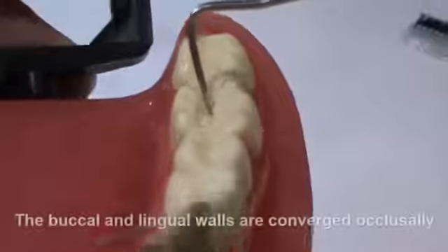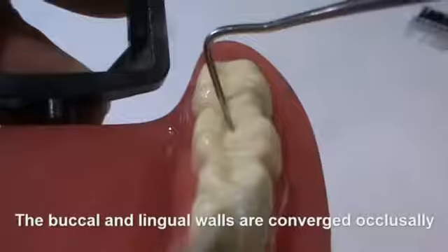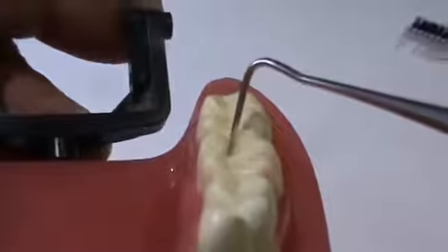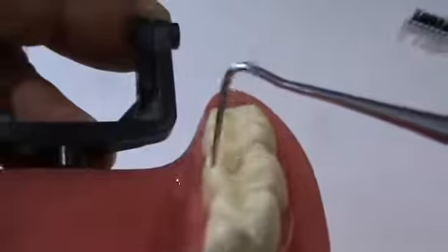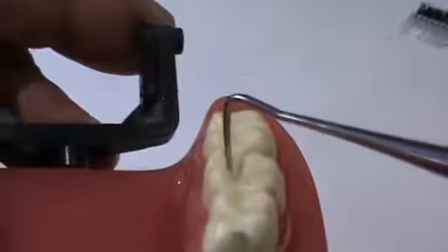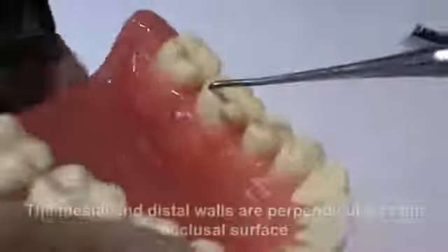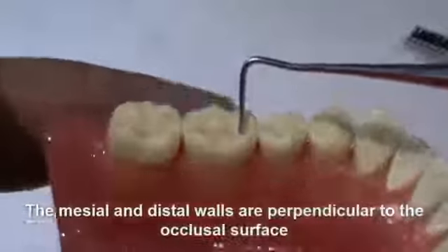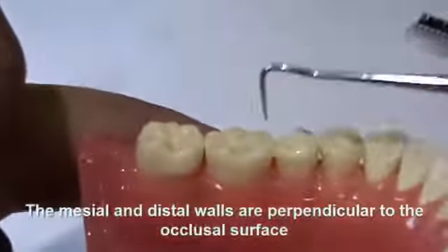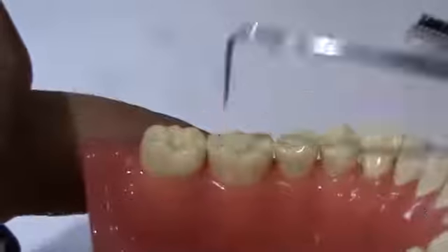The wall, buccal and lingual under the cusps must be converged occlusally. While the mesial and distal wall at the marginal ridges should be perpendicular or slightly diverged.